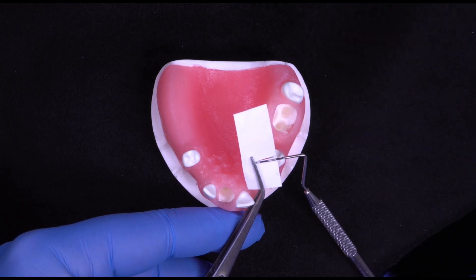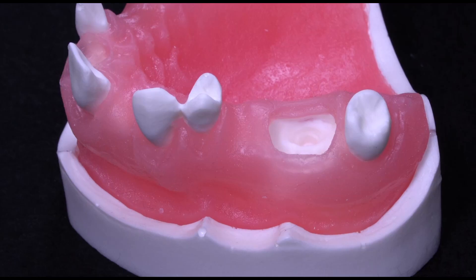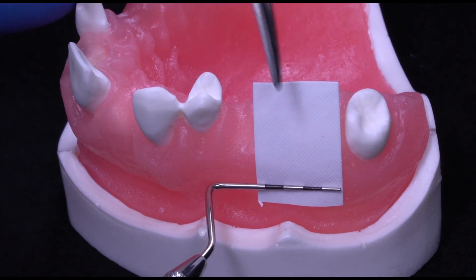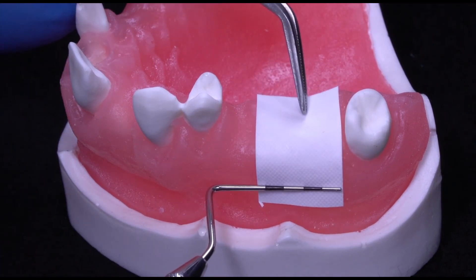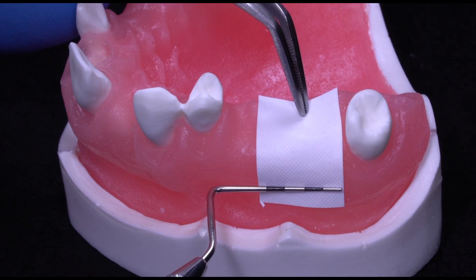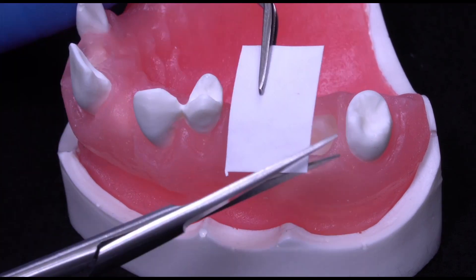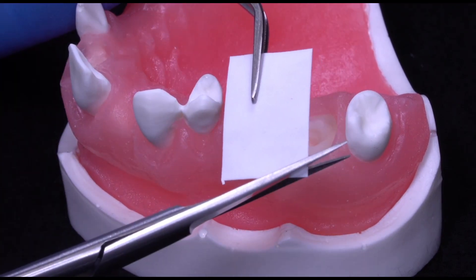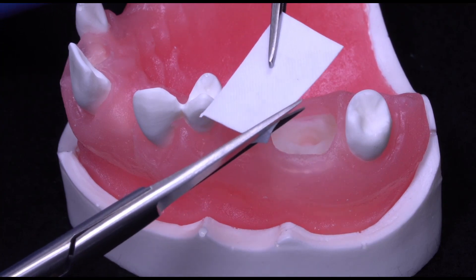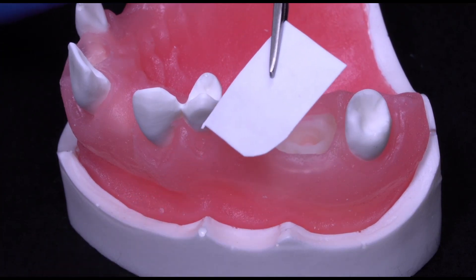The template can be trial placed over the extraction site to verify the size and shape. Once the template is cut to size, the corners are rounded to improve the ability to place the membrane between the soft tissue and the alveolar bone.